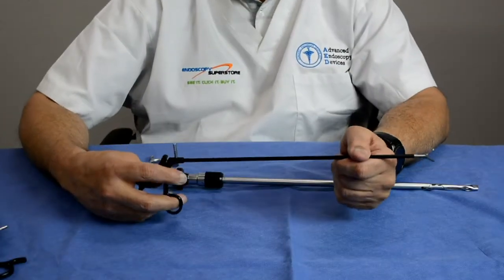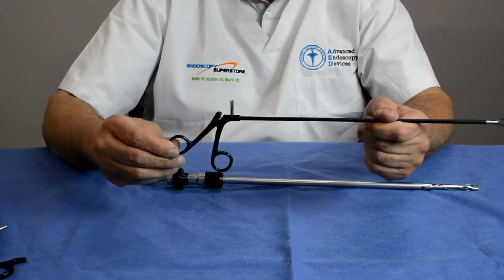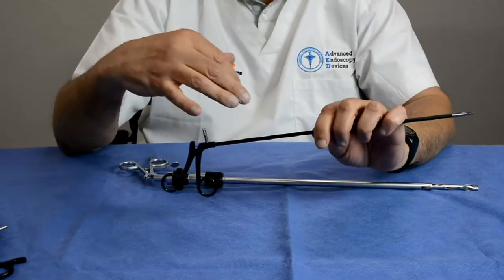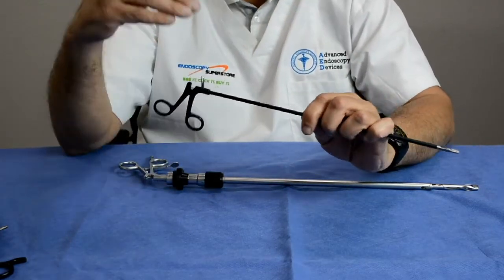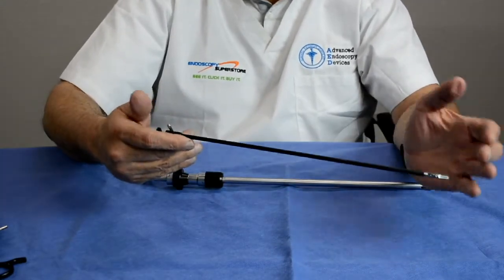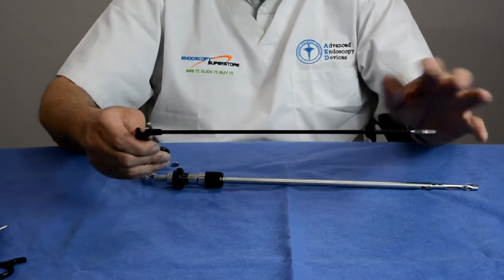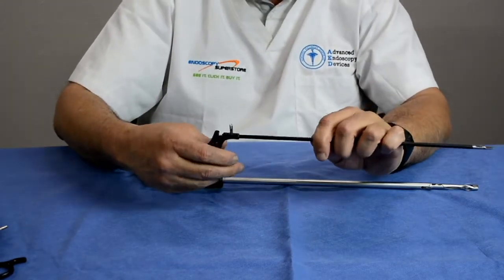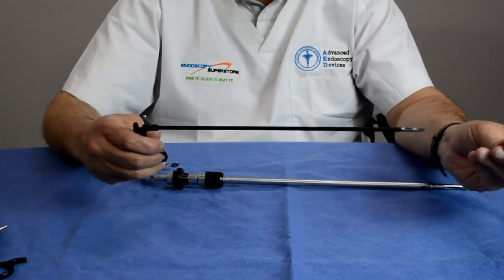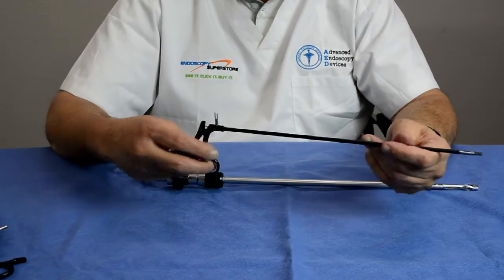As the evolution of laparoscopic forceps progressed, we went from the first generation basic instruments, to the second generation which were rotatable and had irrigation ports, to the third generation which became modular — allowing different parts to be changed, with carbon fiber or polymer handles, single-use disposables, and instruments with replaceable tips.